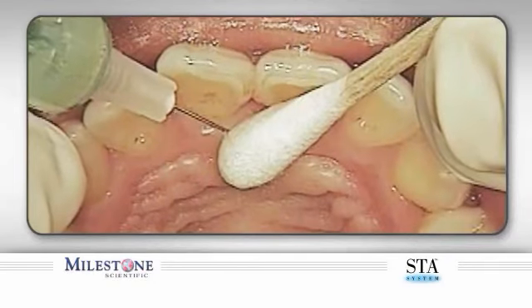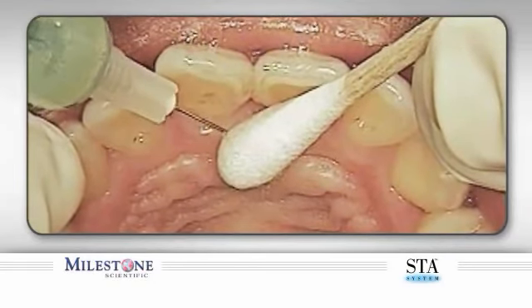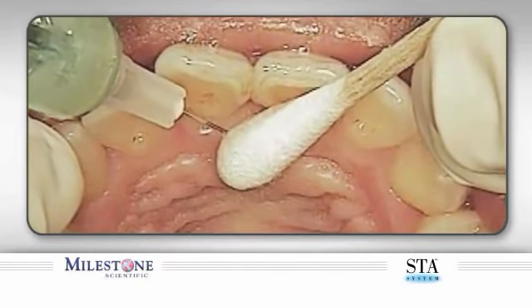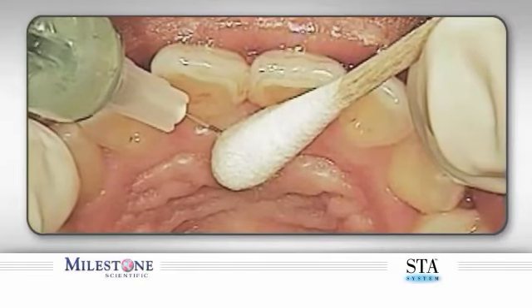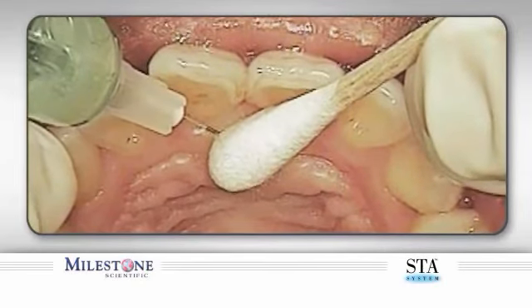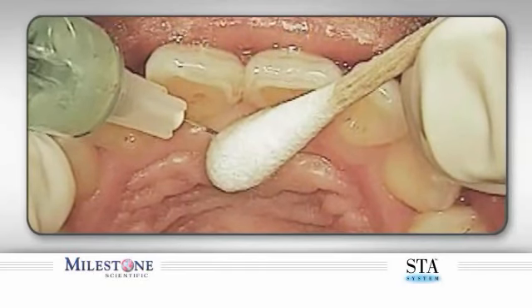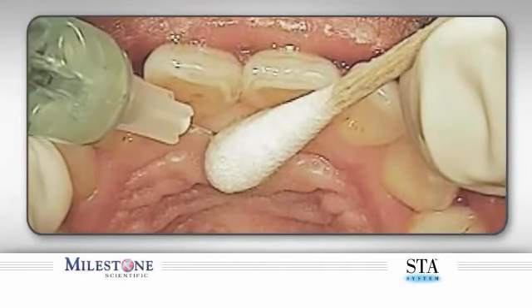Next, simultaneously advance the needle 1 to 2 millimeters while rotating back and forth birotationally. After the papilla has blanched, reorient the needle more vertically to gain entrance to the nasopalatine canal and continue to advance the needle very slowly while simultaneously rotating with bidirectional rotation. Advance the needle within the incisive canal 5 to 8 millimeters.